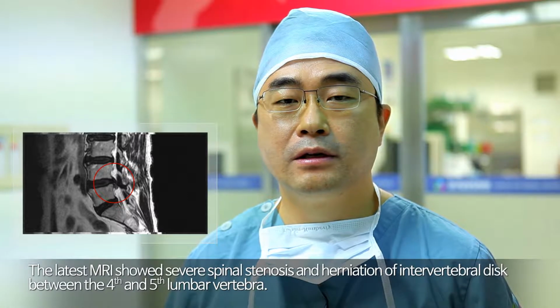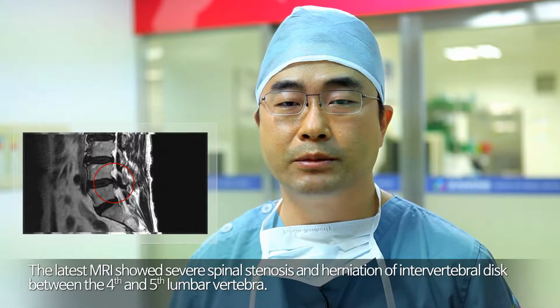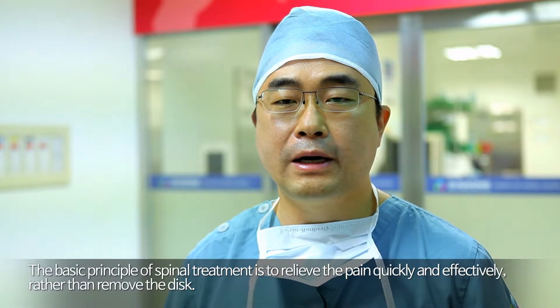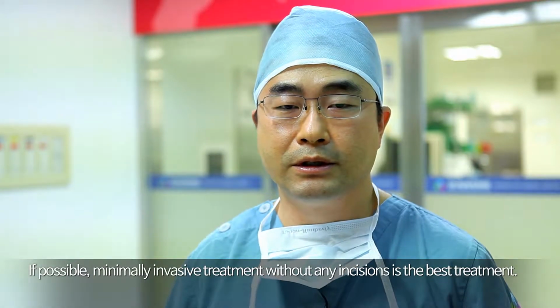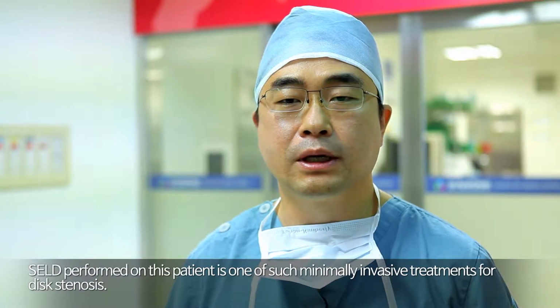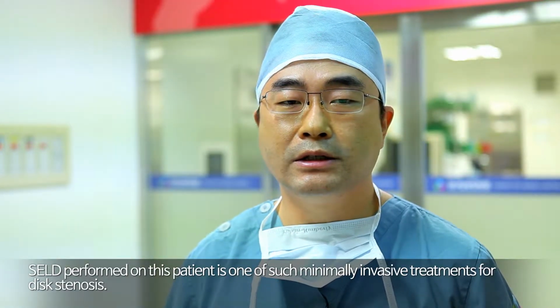The latest MRI showed severe spinal stenosis and herniation of the intervertebral disc between the 4th and 5th lumbar vertebra. The basic principle of spinal treatment is to relieve the pain quickly and effectively, rather than remove the disc. If possible, minimally invasive treatment without any incisions is the best treatment. SELD performed on this patient is one of such minimally invasive treatments for disc stenosis.